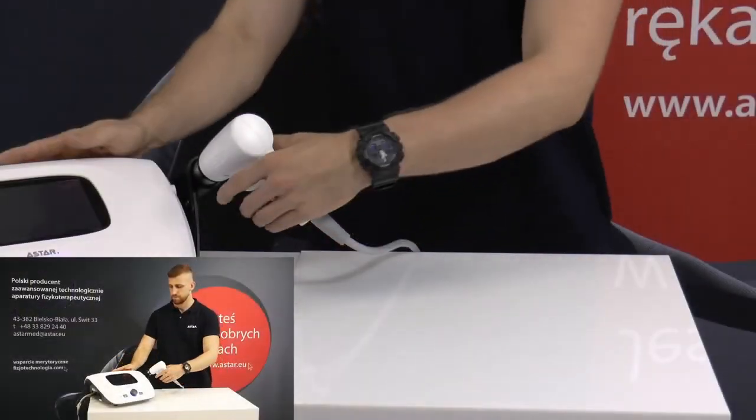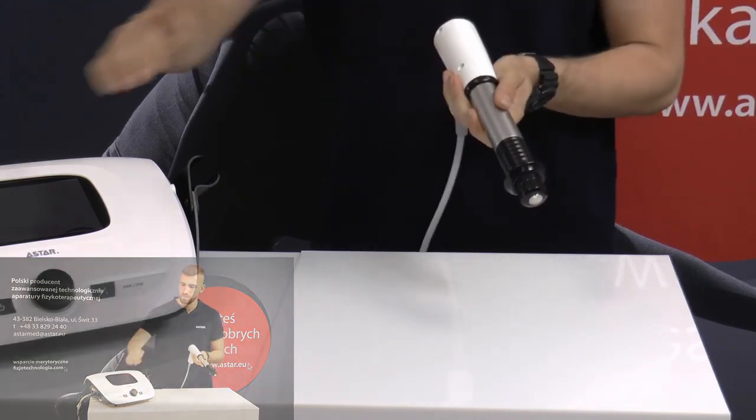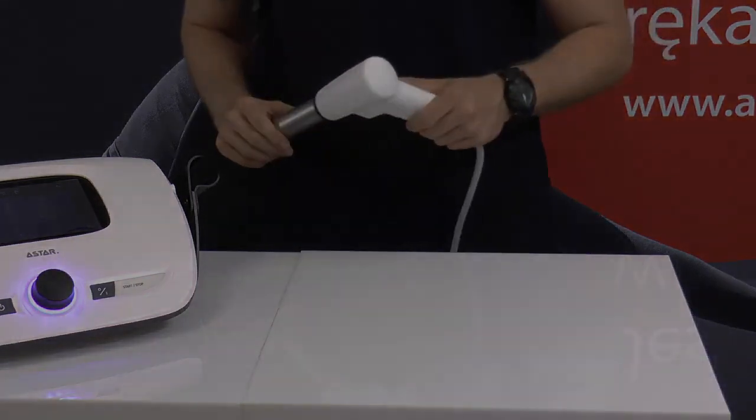Before each treatment, check if the transmitter is fully tightened. If the transmitter is not fully tightened, during operation it may get unscrewed and, as a result, damage the applicator.